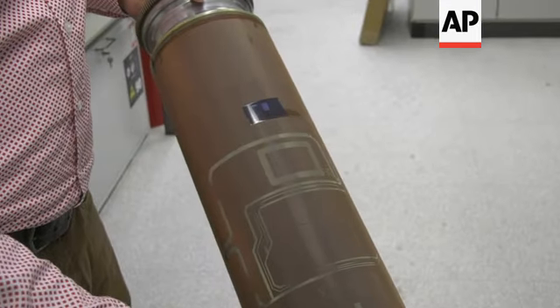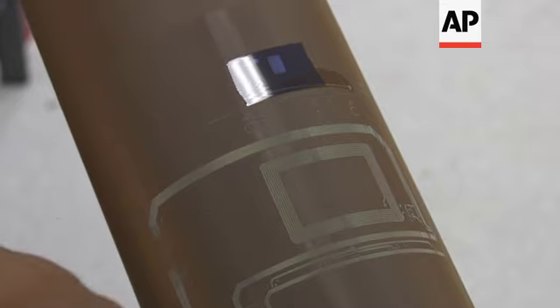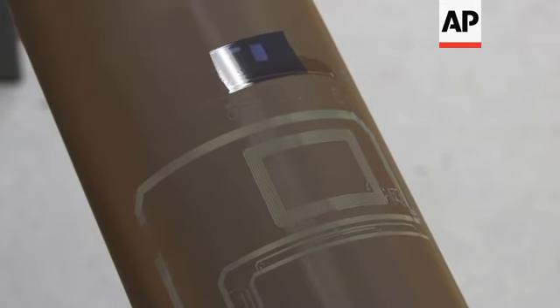A cylindrical screen for a rotary screen printer, which I'll show you in a bit, of course. These are circuit structures that you want to print on your substrate. But you don't want to wear a mask or a garment with bulky box-like electronics sticking around. You want something that's not bothering you at all. It's flexible and completely wearable, so to speak. This is where printed electronics come in.